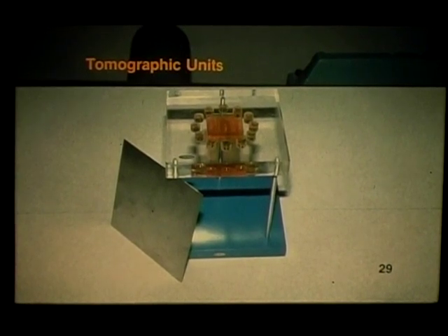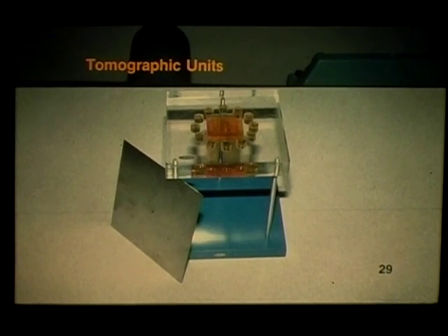The tomographic phantom is used with the simulated patient phantom to measure the accuracy of the tomographic section indicator as well as the thickness of the section at various exposures. The steel aperture plate, with the hole 3.0 millimeters in diameter, is used to demonstrate the uniformity and completeness of motion of the exposure angle. Also, it is helpful to check for obvious mechanical defects by operating the unit in the tomographic modes while visually checking the smoothness of the tube and film and the stability of the pivot points.